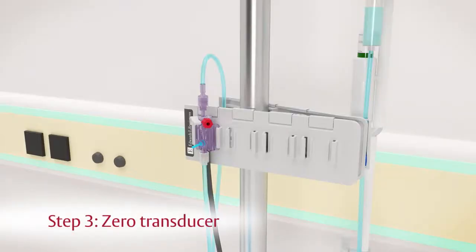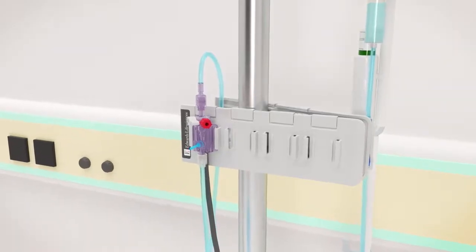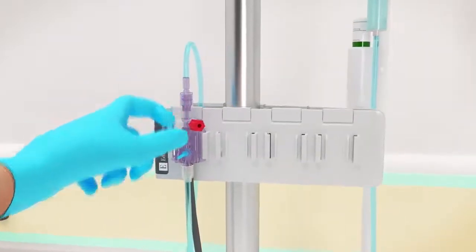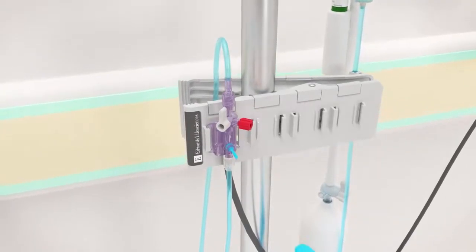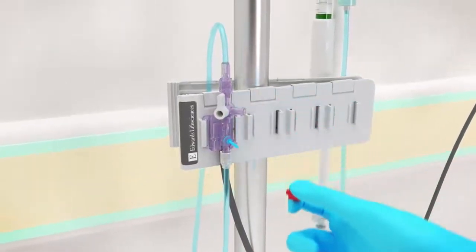Step 3. The TruWave transducer must be zeroed to remove the effects of atmospheric pressure. Open the stopcock above the transducer to atmospheric air by turning the stopcock toward the patient's pressure tubing and away from the TruWave transducer. Then remove the non-vented cap. Perform this maneuver while maintaining sterility of the cap and stopcock port.